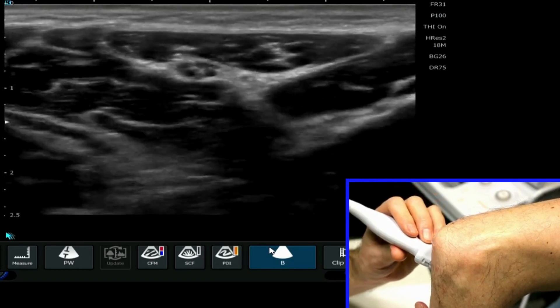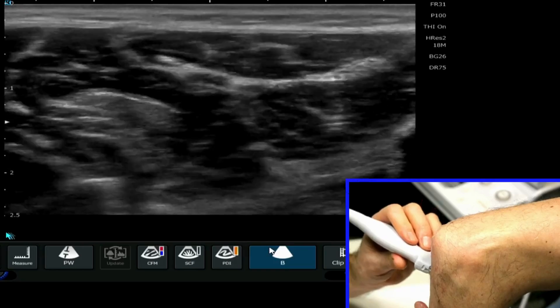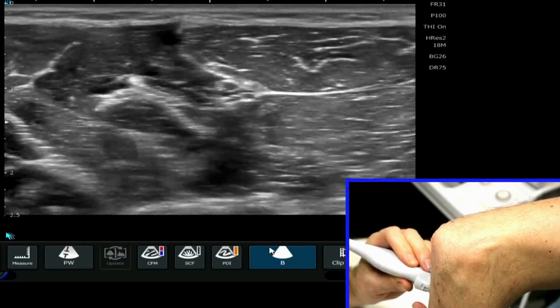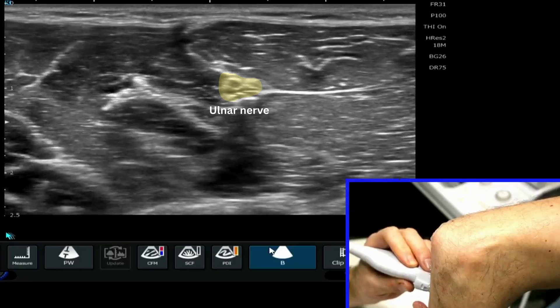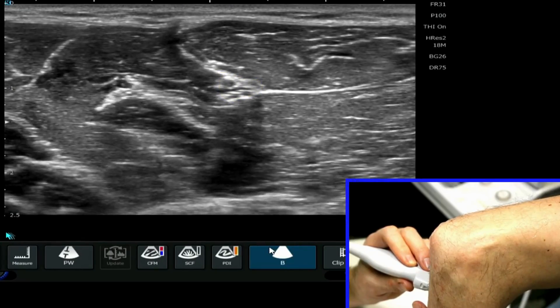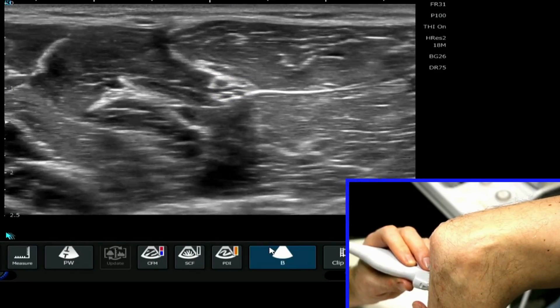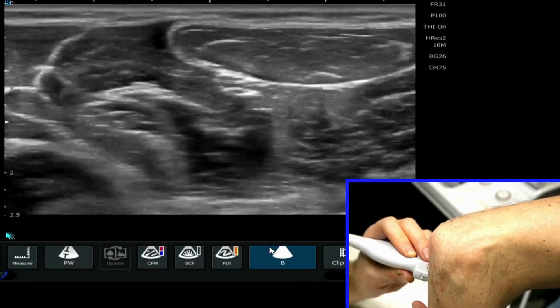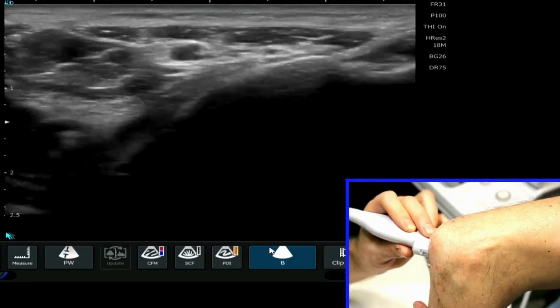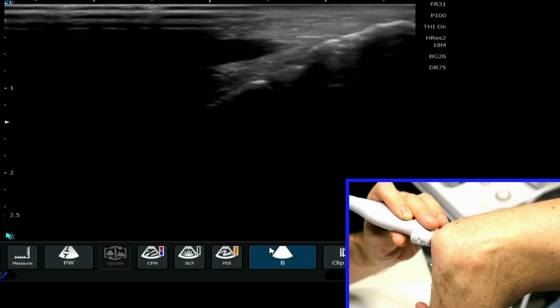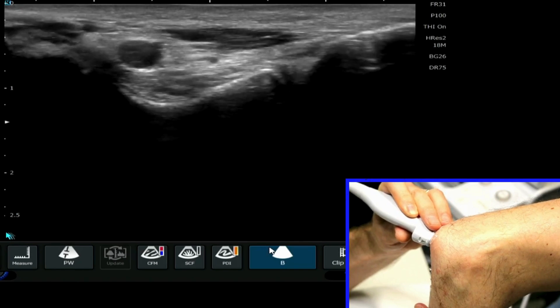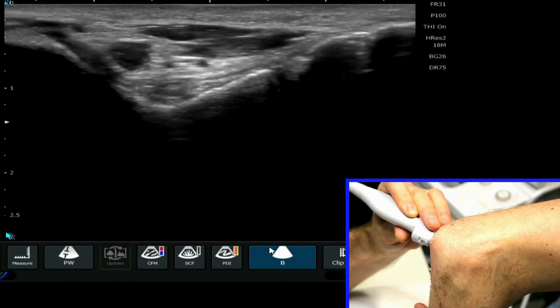As I scan down, the ulnar nerve becomes very much more apparent, sitting here below the two heads of the flexor carpi ulnaris. I'll bring the probe back up into the cubital tunnel, and now it's much easier to see that ulnar nerve.